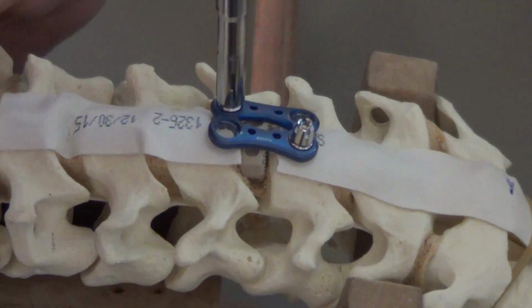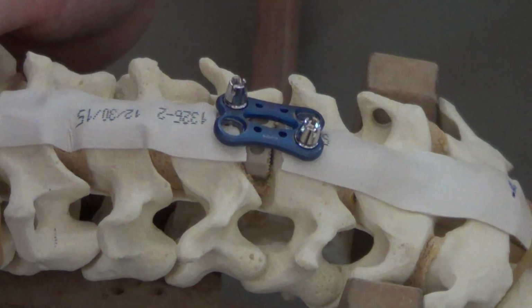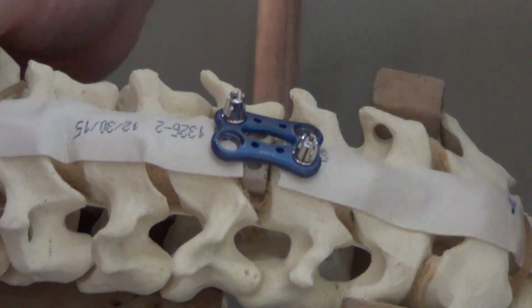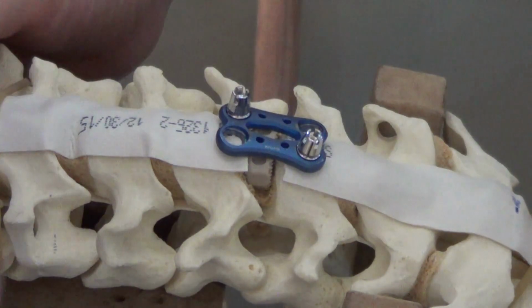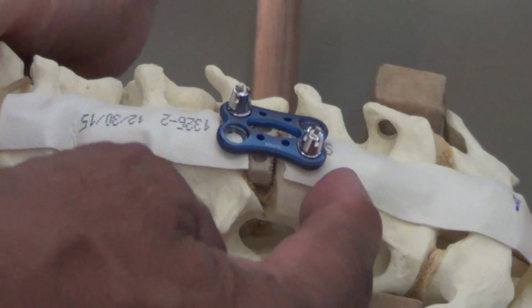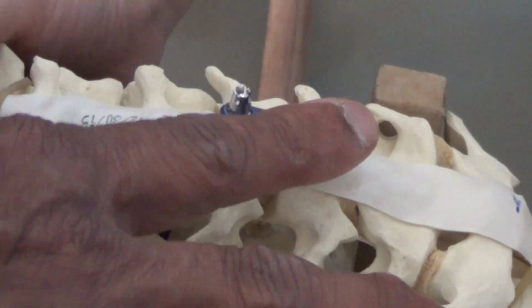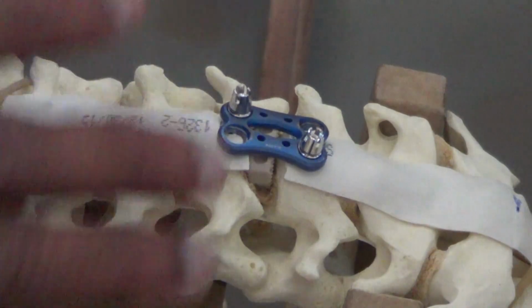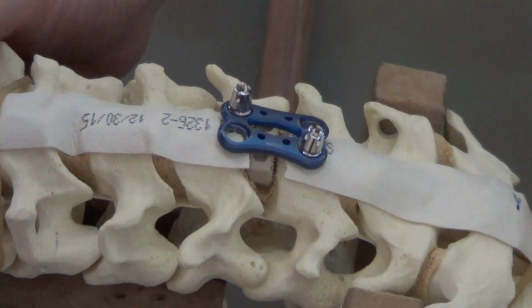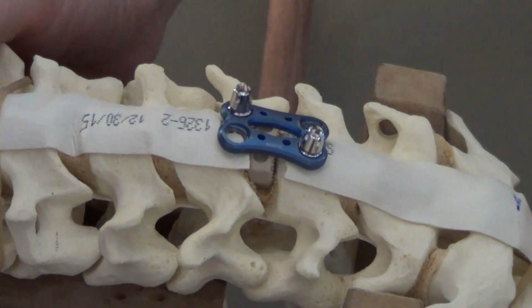So once you have put this pin, what you do, you take an X-ray. You take an X-ray, do an AP, see that the alignment of the plate is in the center, and also lateral to see that the pin is in the vertebral body, not too near to the disc above or disc below. Once you are happy with the pin in the AP and lateral view, then you put your screws. Now, what is the size of screw?